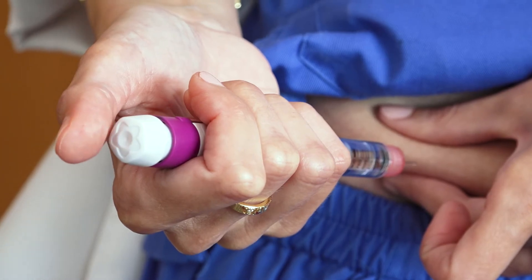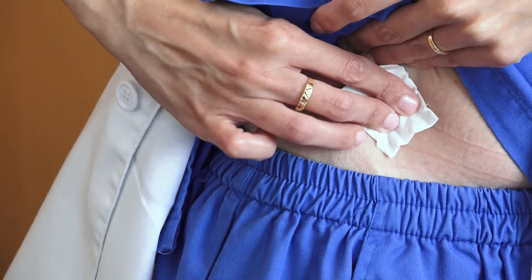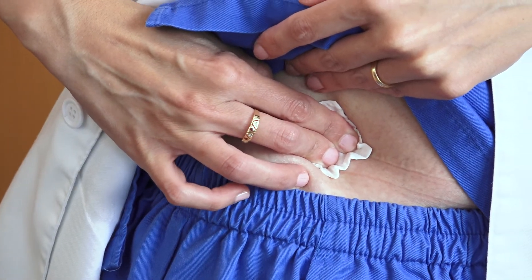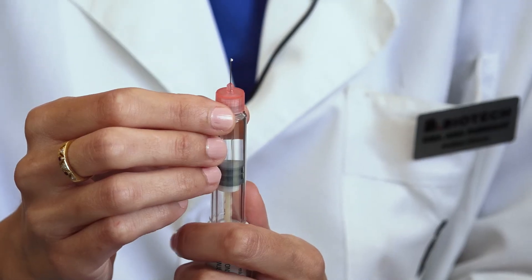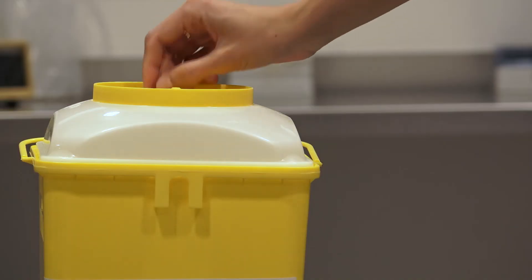Inject the drug by pressing on the top part of the self-injection pen. Then press down on the area of the skin with cotton wool and alcohol. Following administration, remove the needle and dispose of it in an appropriate refuse bin.